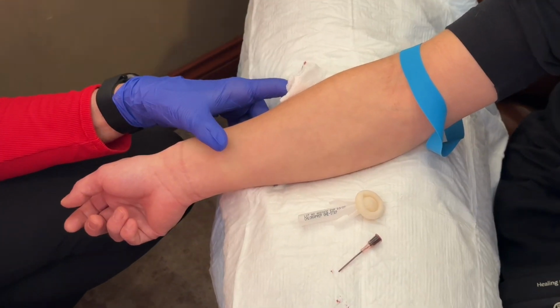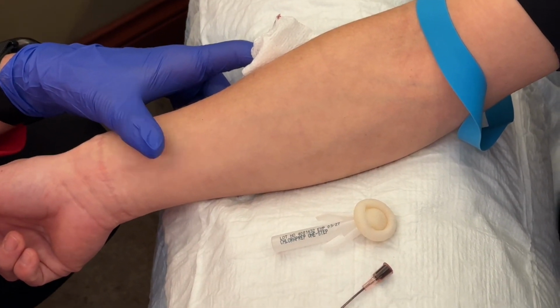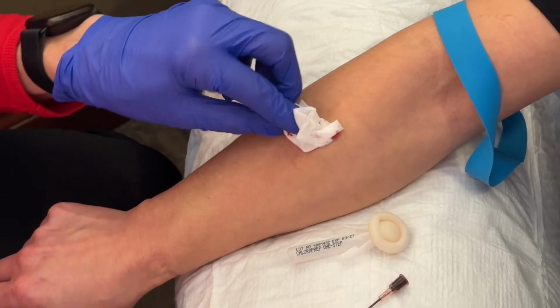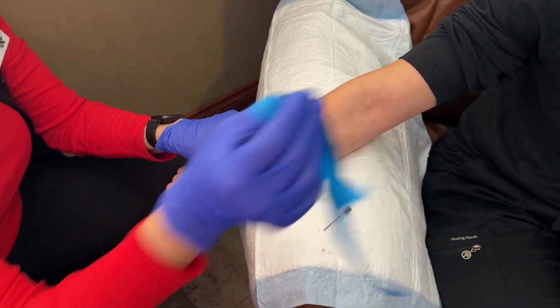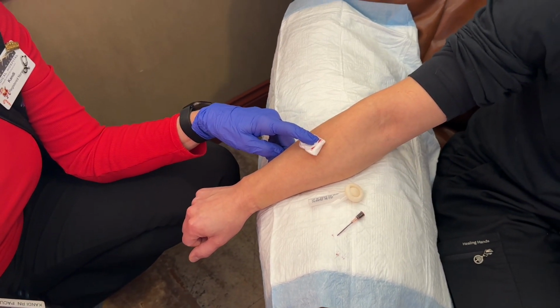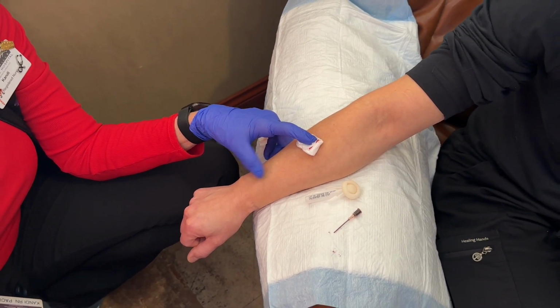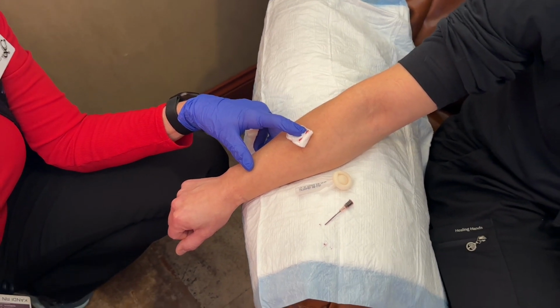So I do most of my IVs by feel. If you can feel a vein, they usually have a lot more girth than this little tiny superficial one you can see on the hand. I can promise you it's a much bigger vein. So choosing a good vein usually will help also. But I'm here, William's here. We're not afraid to let you guys come poke us with lidocaine. So anytime you want to come up and practice on us to get comfortable with it, feel free to come find us. Okay. All right.